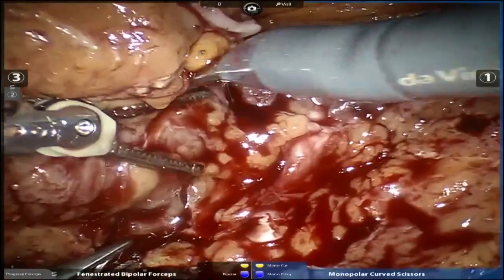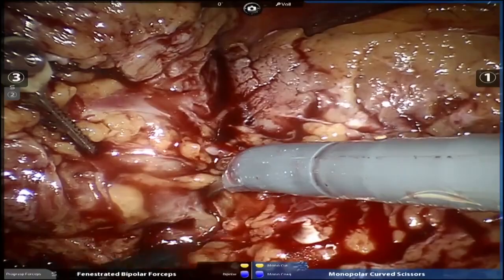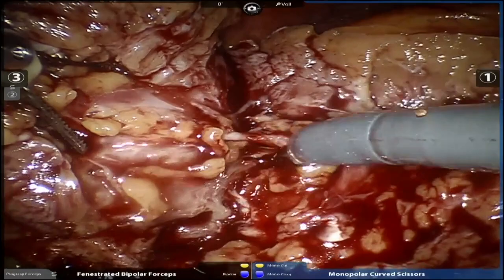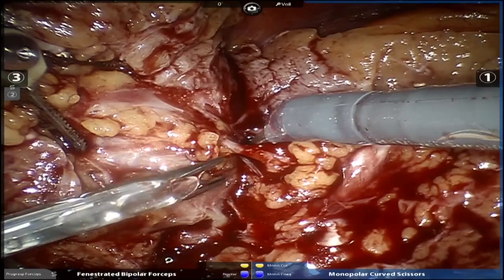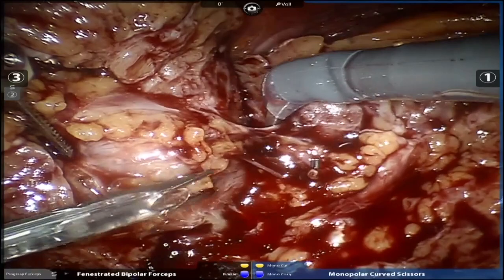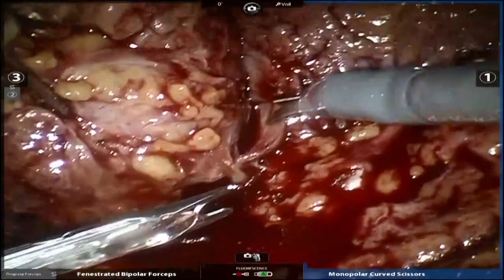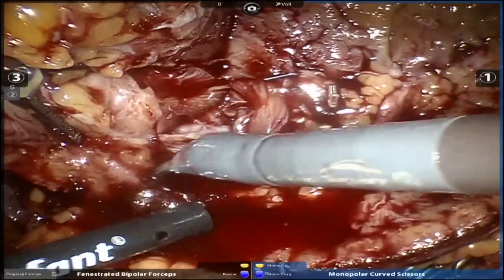Okay, suction back. Another clip. Right here. Best you can. No. Up here, higher, right there. Yes. Good. That's all right. One more. Don't go away. Right here. You're beautiful. Nice job. Don't go away. Okay, sucker back. Suck here, please.